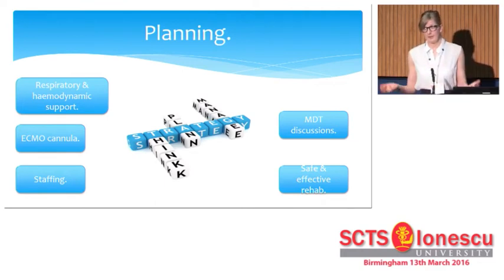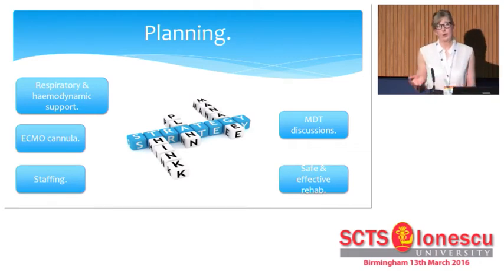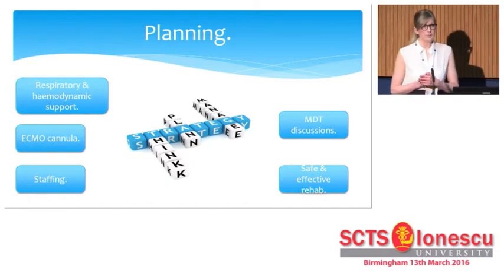So we had comprehensive discussions as an MDT to see if we could appropriately manage the risks. And to give you an idea, those discussions involved our surgeon who cannulated the patient, the intensivist, the transplant consultants, our perfusion team, ECMO specialists, ECMO trained nurse, myself and my senior, and of course the patient. And we decided that we could manage the risks appropriately and that we could start rehab sessions.